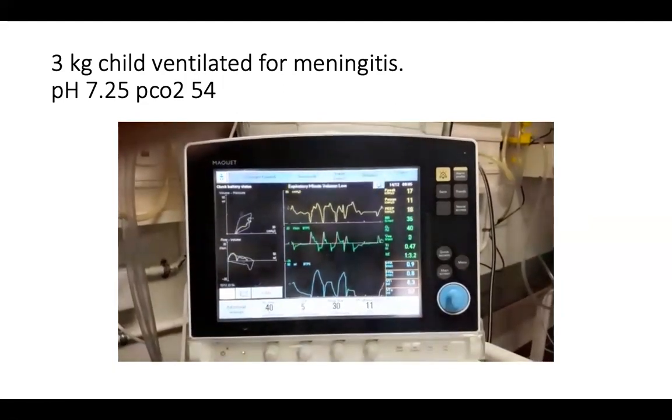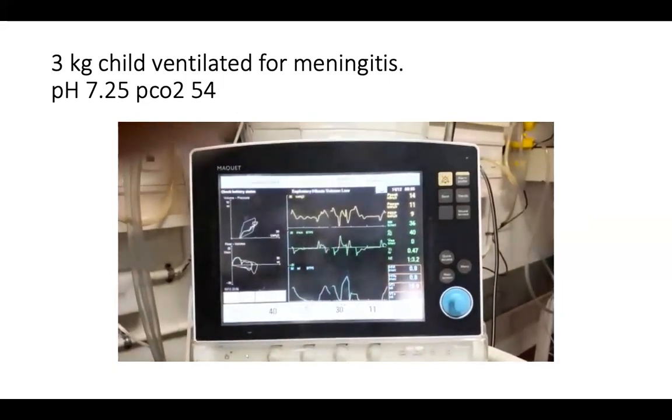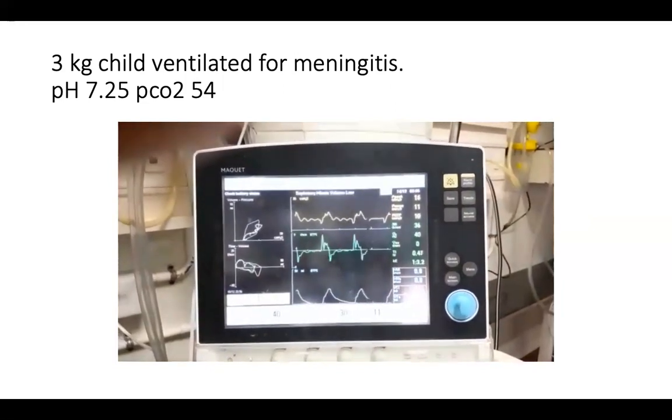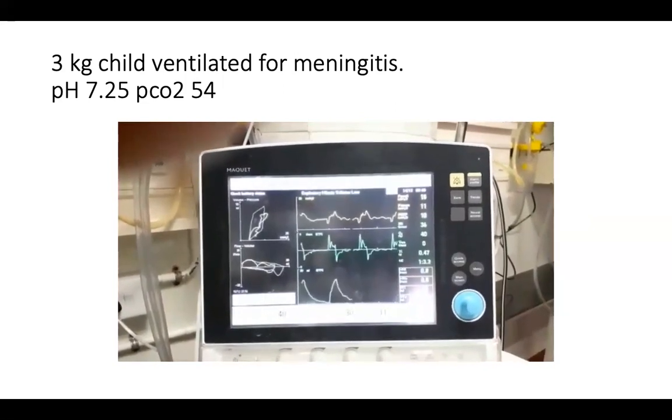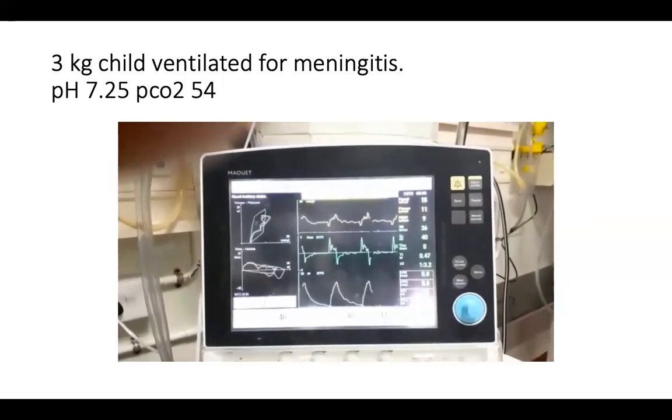That I'm very, very sure about, because you can see the graphs are all abnormal. They are serrated, the tidal volumes delivered are not normal. So this is the commonest cause of hypercarbia. That is when you have secretions in the tube, when you have water in the tubings, when there is a partial tube block, all that would be the reason for PCO2 increasing. So every time you come across such a graph, go ahead, suction, remove the water, and just patiently wait. The CO2 would definitely come down. There is no need to change your ventilator settings for this.